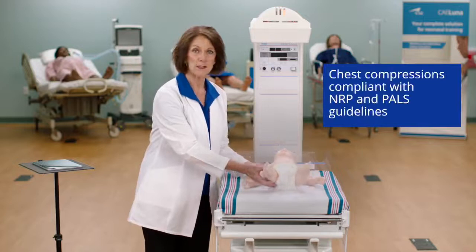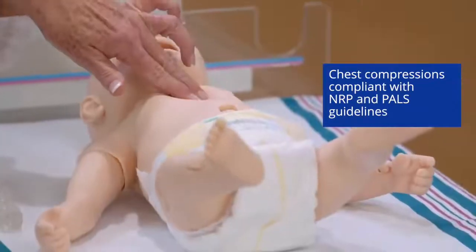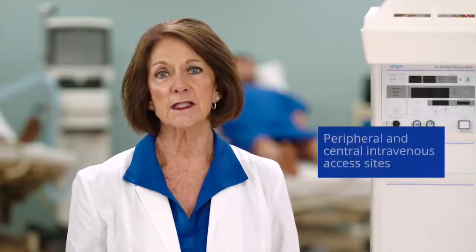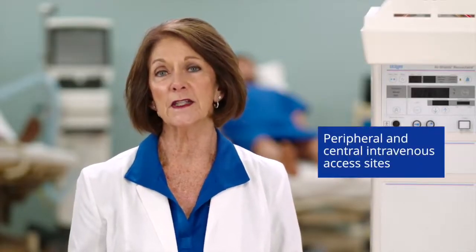Luna supports chest compressions compliant with NRP and PALS guidelines, and Luna provides various sites for peripheral and central intravenous access.